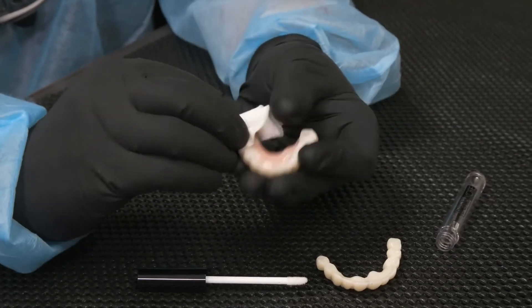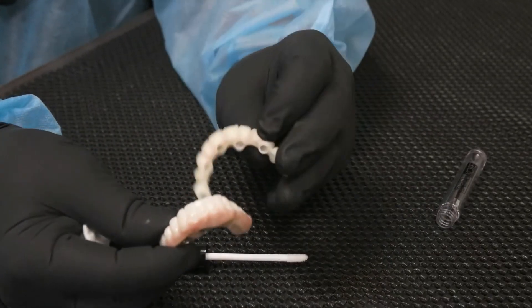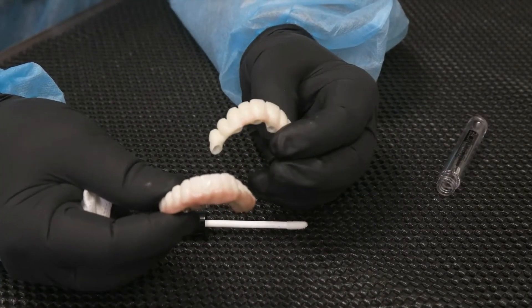Both these implant bridges are now fully protected, ready to go in the mouth and protect against calculus and bacteria overloading these areas.